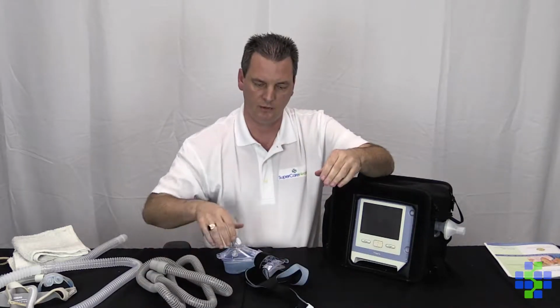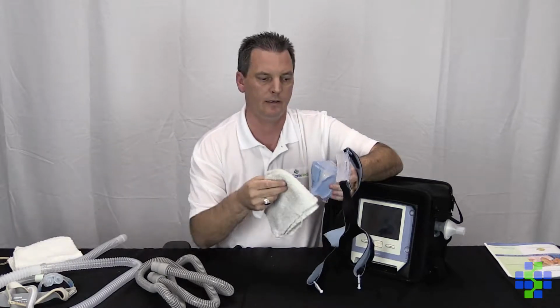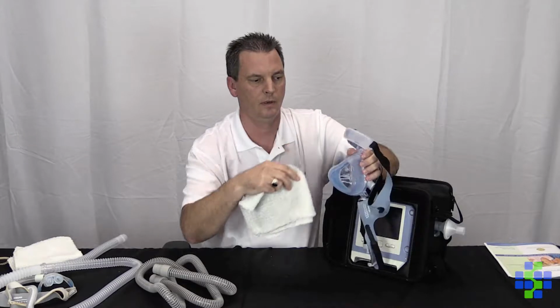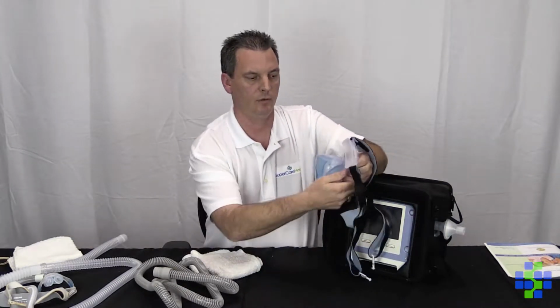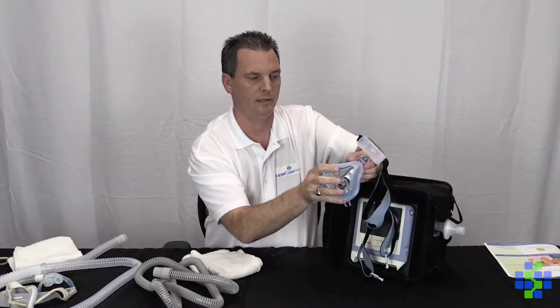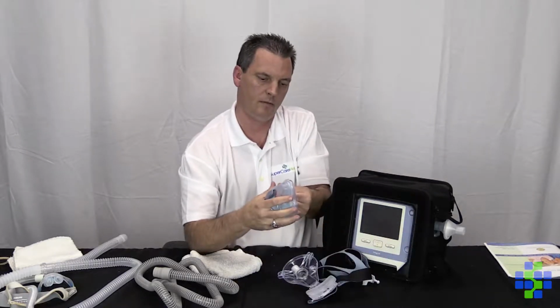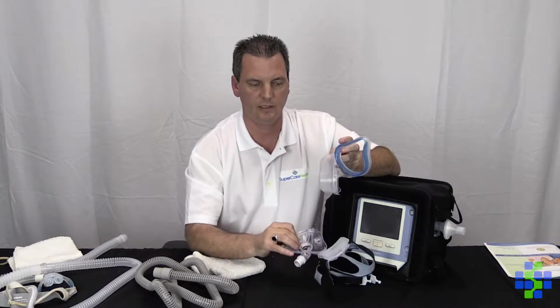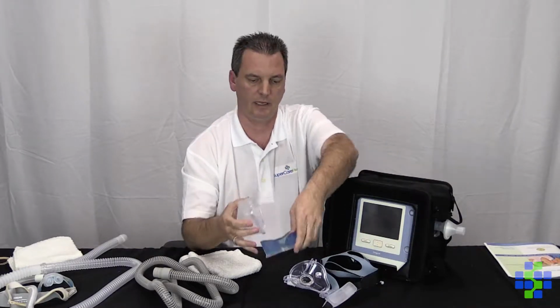When you're ready to wash your mask, I recommend using a damp cloth every day and just keeping it clean by wiping it down. Every other day I would probably do a deep clean, and I would remove the interface by detaching the gel. I'm going to wash these pieces, including this, in soap and warm water, and then let it dry afterwards.